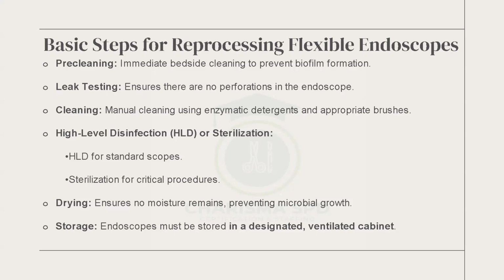And then, if it is supposed to be sterilized with low temperature, they have to do that. And if it is supposed to be high level disinfected, then it has to go through that process, either using the machine for high level disinfection or the manual process. Okay, right. HLD for standard scopes and then sterilization for critical procedures.